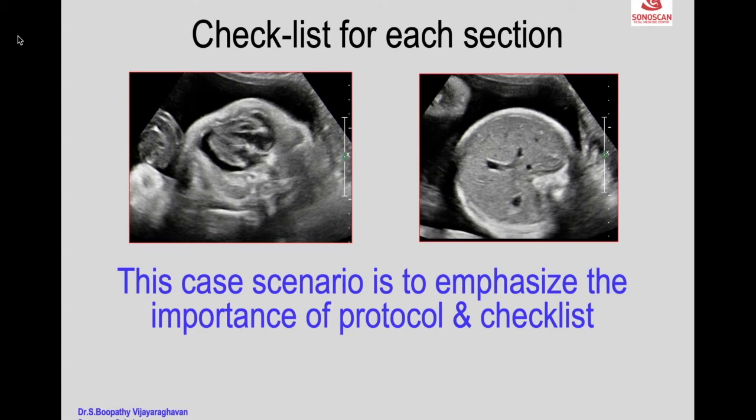So we all know that besides guidelines, when you take a section, you have to follow a checklist for each section. So this case scenario is to emphasize the importance of protocol and checklist.